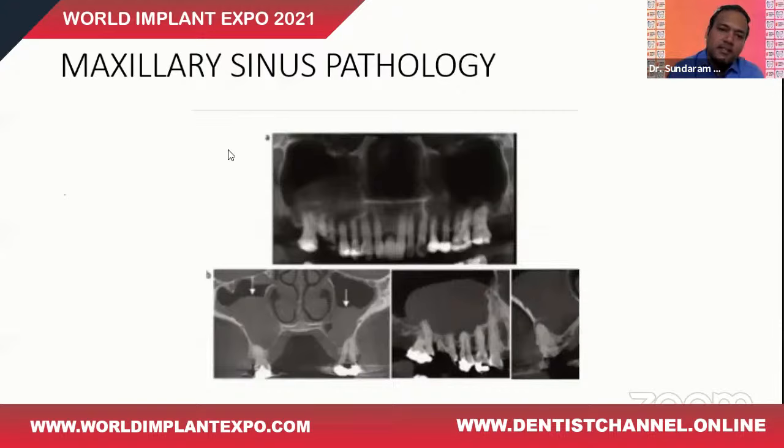This slide depicts the maxillary sinus. For instance, I am planning to remove the upper molar over here and then plan for an implant, and I need to study the sinus. With an intraoral periapical radiograph, probably I will get an idea of where the sinus lining would be. And I would definitely be planning for a sinus lift, bone graft, and then wait, or I can immediately place the implant depending on the situation, without having any idea of what is happening inside the sinus.